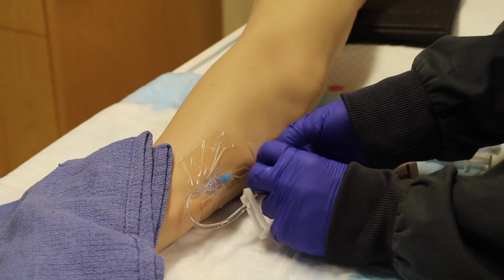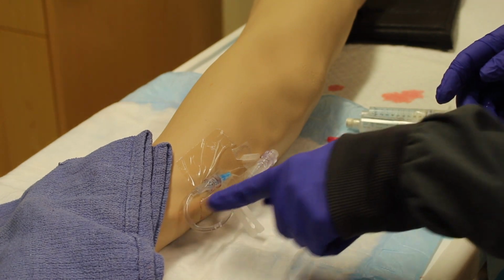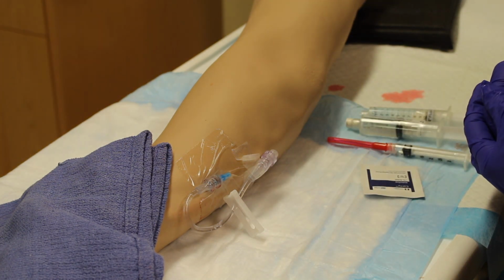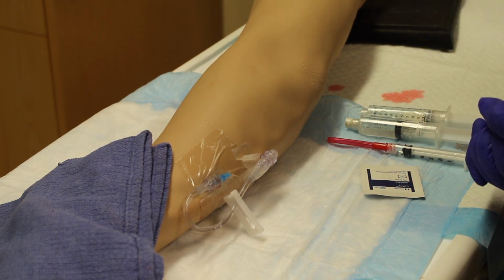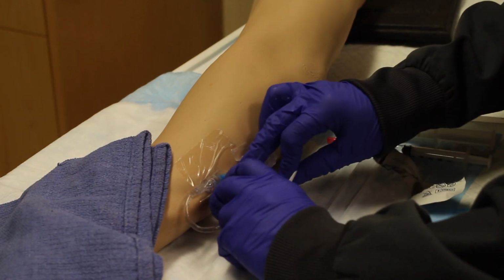Next, we will administer through an intermittent device with IV extension tubing. Determine the volume of extension tubing that is attached to the access port. This is important because it will help you in knowing how much flush you will need to flush the medication all the way through the tubing. Scrub the surface of the injection port with alcohol according to facility policy. Again, this is usually at least 15 seconds.